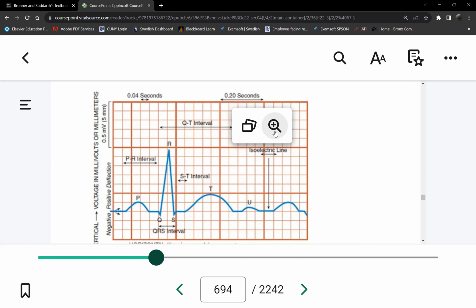You can fix the ST elevation, right? That requires immediate cardiac catheterization. The patient needs to go to the cath lab. With ST depression, yes, the patient had a heart attack, but not anymore, so we have time, maybe 6 hours, maybe overnight. Think of it this way: the patient had a heart attack, but the blood flow was restored. Does that make sense? That's if we see ST depression.